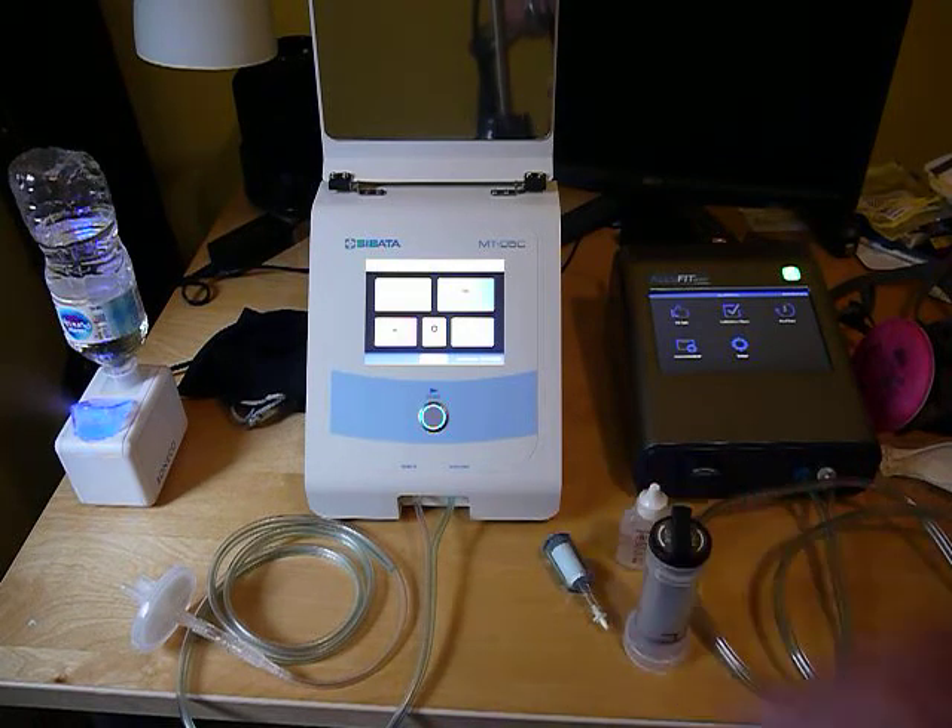Either of the fit testers should be stored at room temperature. You wouldn't want to leave them outside in your vehicle and then bring them in, especially if it was cold out. You want to have it starting out at about room temperature.